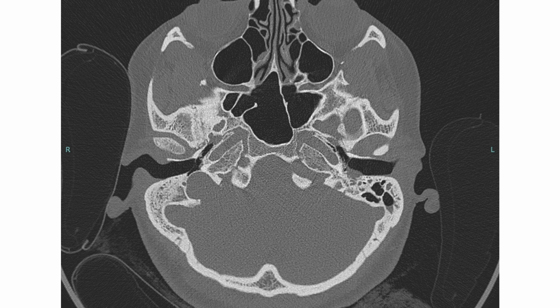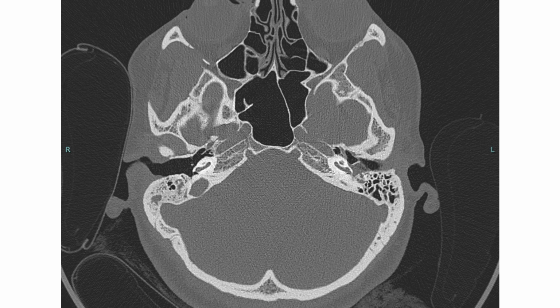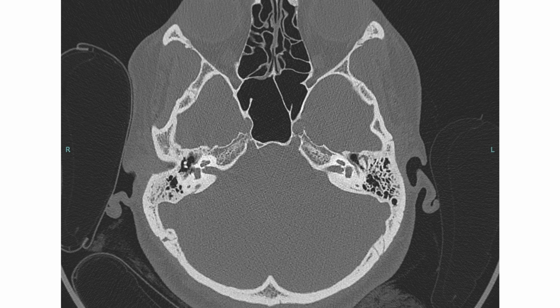The left side temporal bone CT shows presence of soft tissue in the posterior mesotympanum in this patient with left-sided chronic otitis media. One can see anterior pneumatization in the middle ear towards the protympanum. However, the posterior mesotympanum appears to be totally opacified with presence of soft tissue, which is difficult to categorize on the CT as to whether it is epithelium or cholesteatoma or granulation tissue.